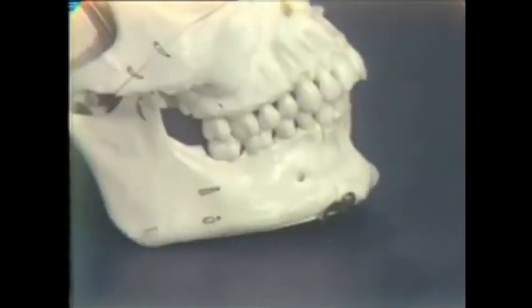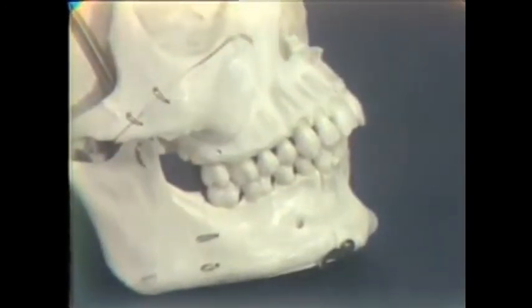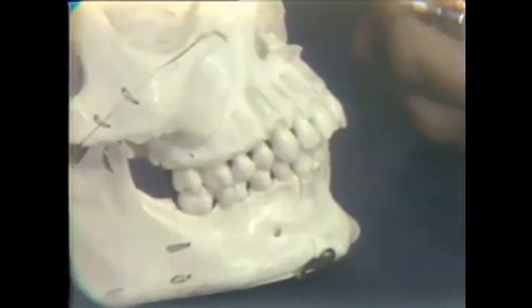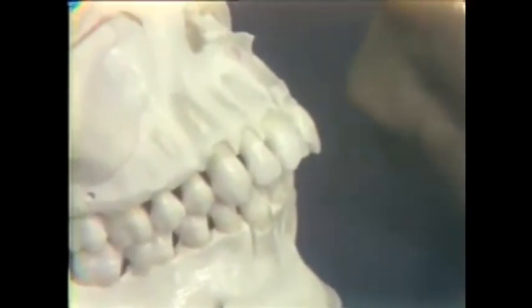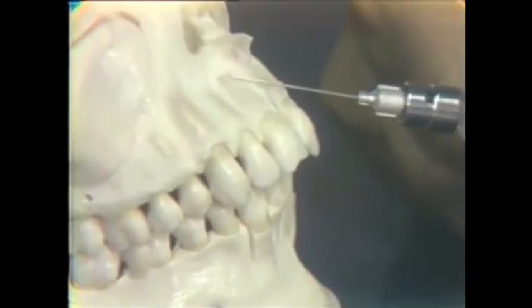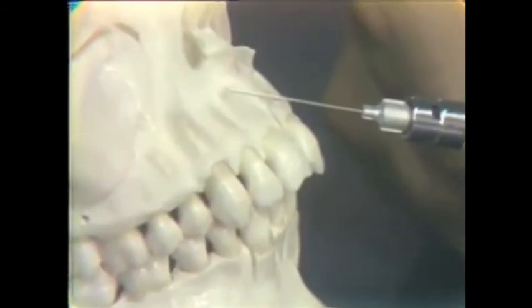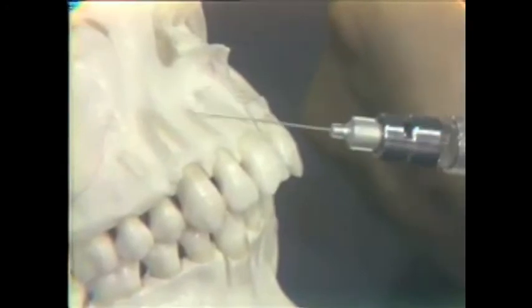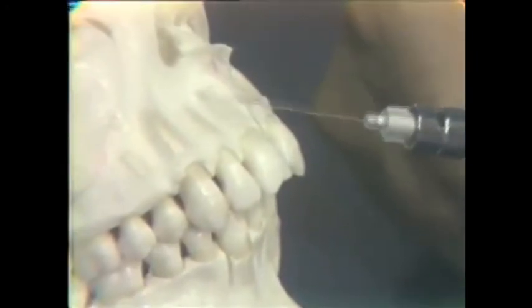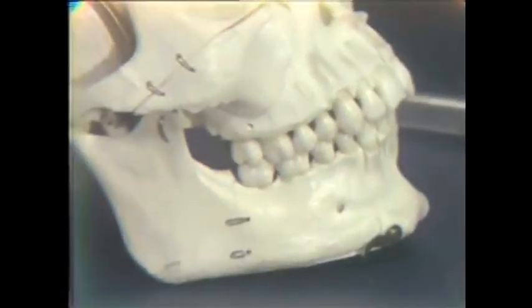To anesthetize the incisor teeth, again, same technique, labial infiltration, with the mouth half closed, lip retracted anteriorly. The needle bevel can be carried in through the vestibular tissues and quickly against bone at a level of or above the apices of the roots of either the central or the lateral incisor tooth, depending upon the tooth you're going to carry out the instrumentation upon. All right, let's again show it on the patient.